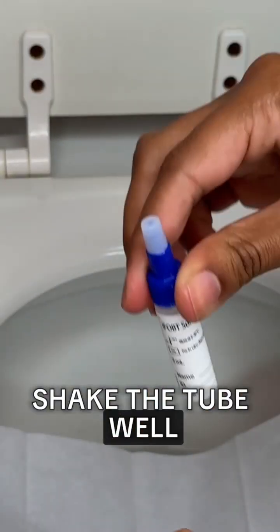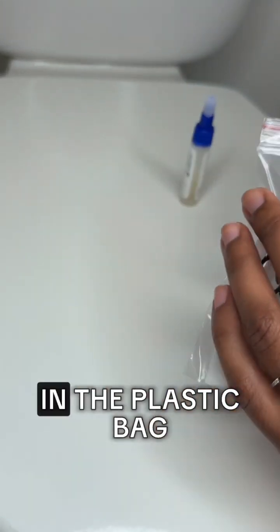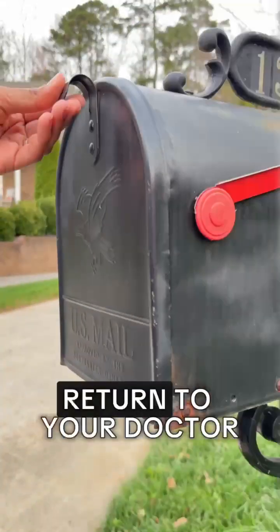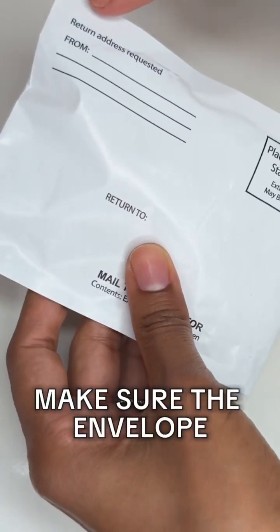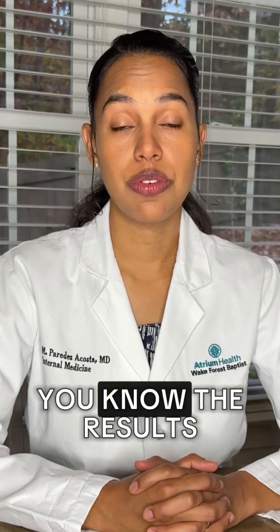Firmly tighten the screw cap and shake the tube well to mix the stool sample and the test solution. Place the sample tube in the plastic bag and insert that in the envelope. Return to your doctor either by mail or in person. If you return it by mail, make sure the envelope has two stamps and the correct address. Your doctor will let you know the results.